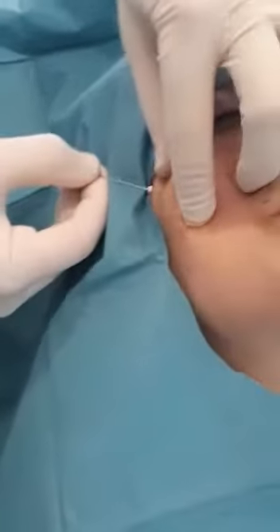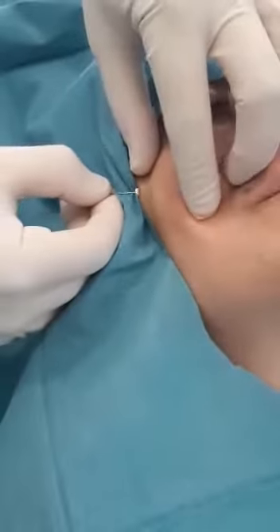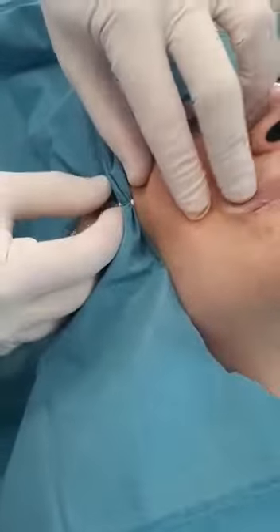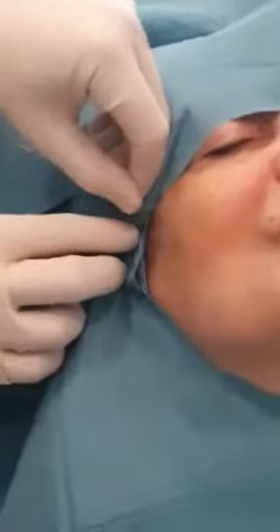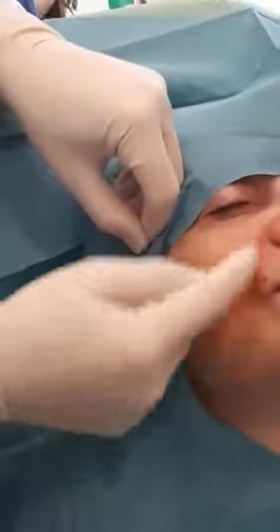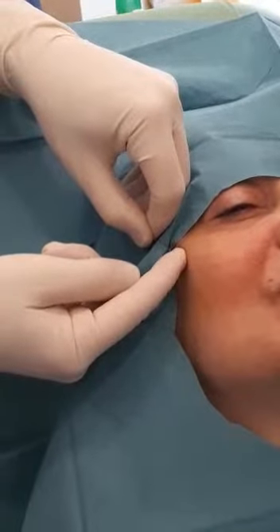You pass through, and then you just reach the lip, and that's it. Okay, look at this again. See how it works under the chin.